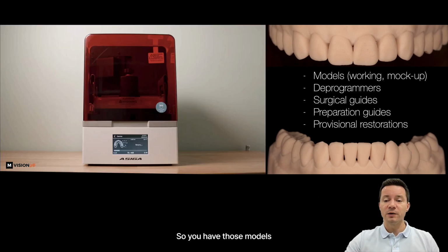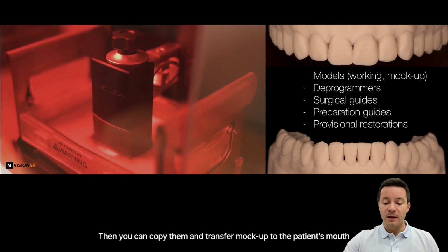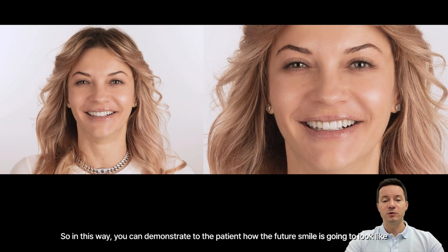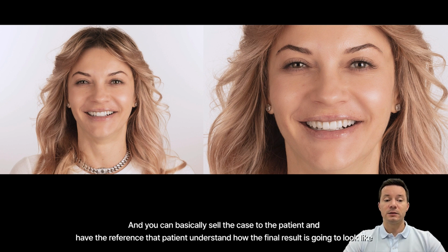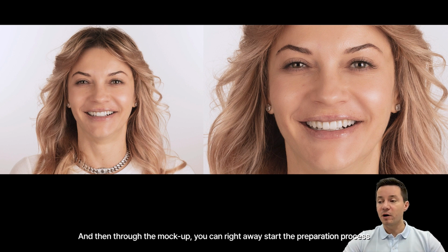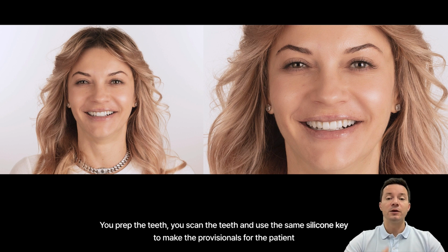So you have those models, then you can copy them and transfer a mock-up to the patient's mouth. So in this way, you can demonstrate to the patient how the future smile is going to look like, and you can basically sell the case to the patient and have, again, the reference. Patient understand how the final result is going to look like, then they accept the treatment, and then through the mock-up, you can right away start the preparation process. You prep the teeth, you scan the teeth, and you use the same silicone key to make the provisionals for the patient.